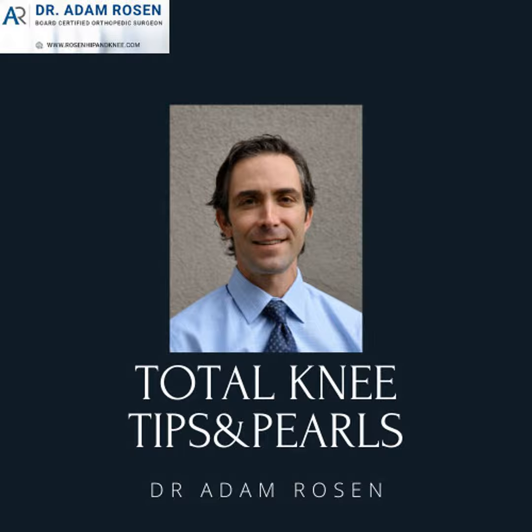So once you get the femur off, I then go on to the tibia if we're taking the tibia off. Especially if you have a posterior stabilized design, you've got a big hole, so you want to protect that area, usually with a lap, to get things out. There's a few instruments in the market. I actually designed one that I like, which is a 2-prong PCL retractor, but it has a posterior buildup to fill in that box. I still use a lap to protect the bone, but this way it gives me a lever arm to then sublux the tibia forward.